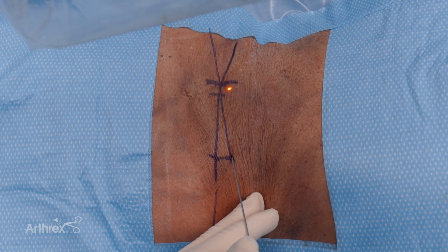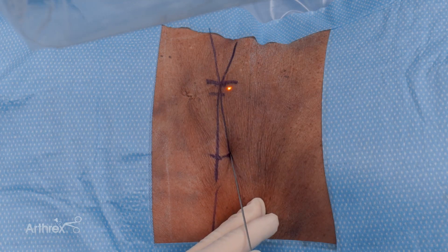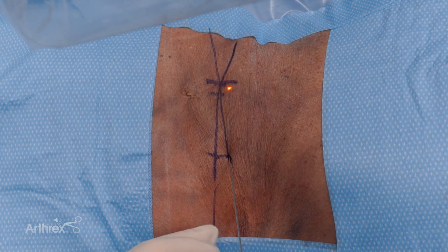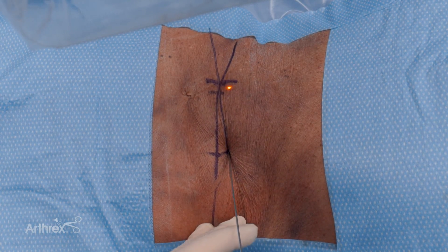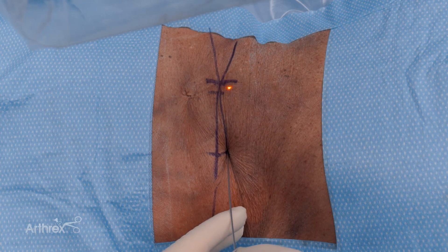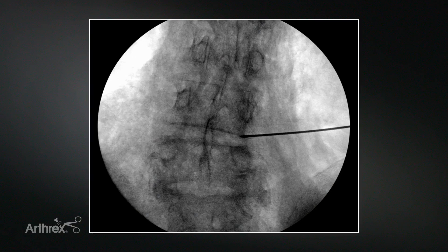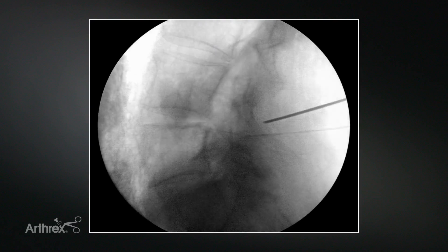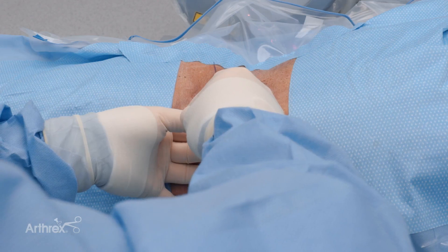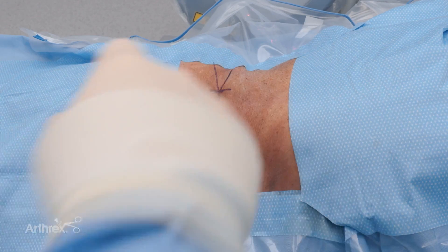Now that the lines are marked, I'm going to insert at our insertion point down about a 30-degree angle towards the foramen. It looks like I'm docked on the lateral facet, so we'll check a lateral view. We can see that we're dorsal, so I'm going to back my needle up, go more ventral, and advance.